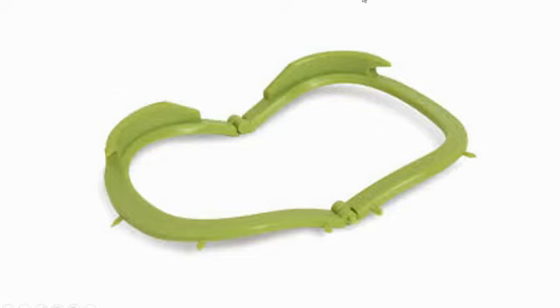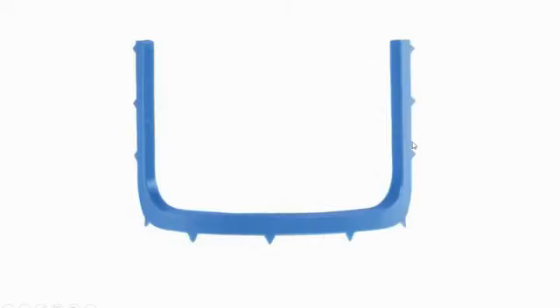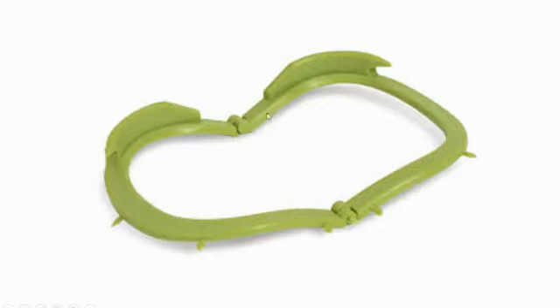This is also second plastic frame. It is a, I'll say, frame in which you can close. Here you can see it's a single unit frame. ठीक है, इसमें 2 पीस फ्रेम है, तो ये फ्रेम फोल्ड हो जाता है। इसका स्पेशली एंडोडोंट यूज आता है कि आपको फ्रेम बार बार निकालना ना पड़े एक्शन लेते हुए, तो आराम से आप इस फ्रेम को क्लोज कर सकते हो। There is a pulley over here, so when you close it, it rotates and you can use it as a half frame also, especially while taking x-rays.